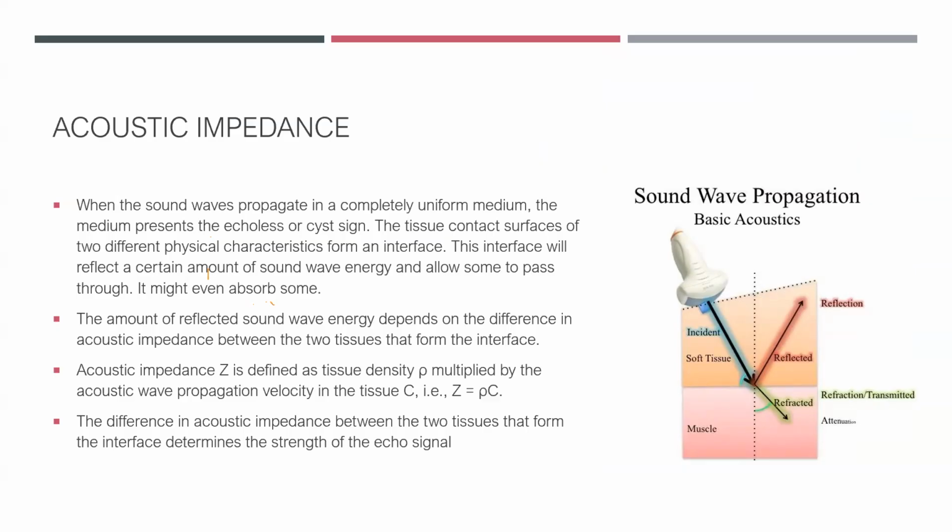So that means that if we are using a higher frequency probe, then the outer layers, the meninges and the structures closer to the meninges, will have better resolution. We can identify them better. But the deeper tissues like ventricles and other nuclei won't be seen as well. That would be darker, right?